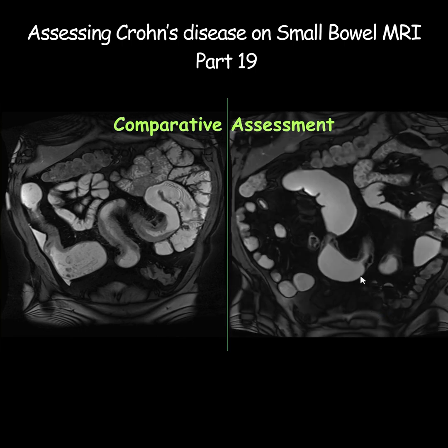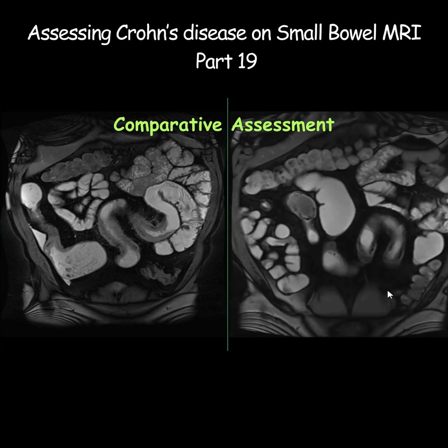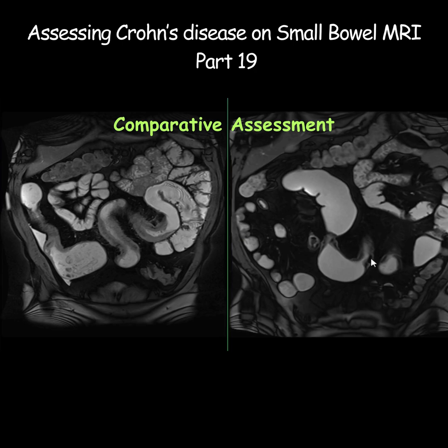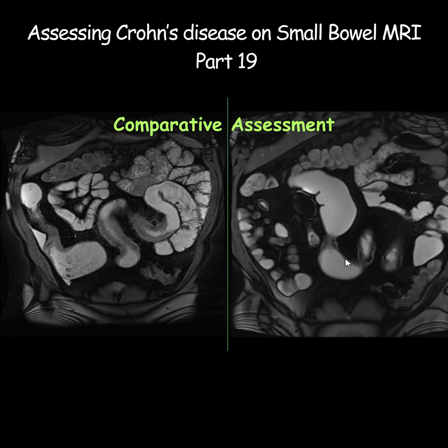Look at this structure. There is significant low T2 signal in the wall, which could either be due to fat — because it's a fat-suppressed sequence — or fibrosis. There is no significant bowel wall edema, there is fat hypertrophy but no significant vascular engorgement and no significant lymph nodes. So this was more fibrous stenotic.